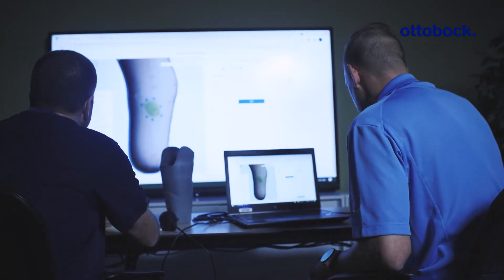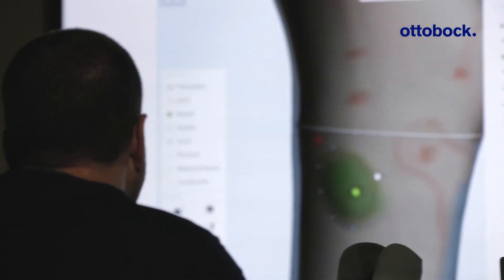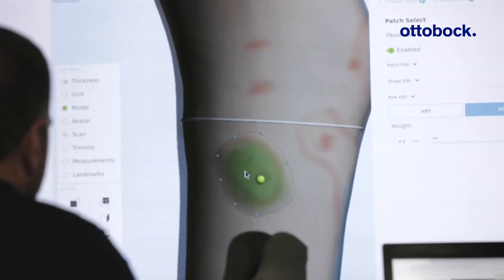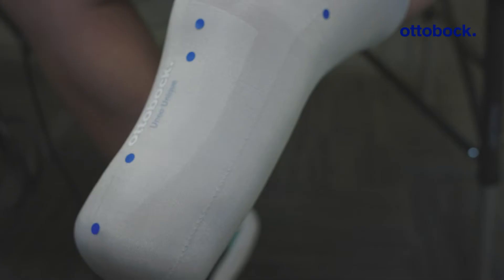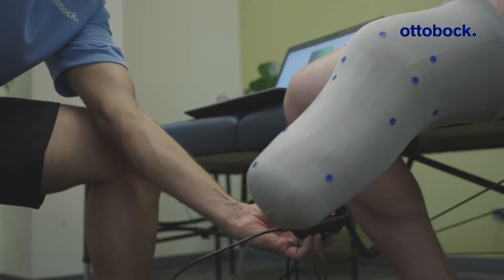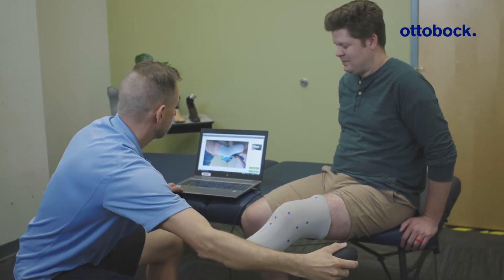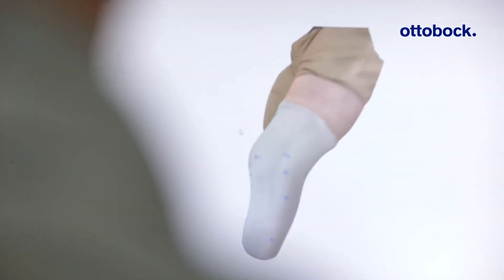The nice part about the easy scan is how detailed the scan is. I can draw all the anatomy on the limb and when I take that scan it shows up in the picture — these are the same landmarks you use in daily practice. Simply mark on your liner using sticker dots to capture the limb shape. What's great is that the scanner also captures the image and texture of your object, so when you go back to modify, you can refer back to those markings.